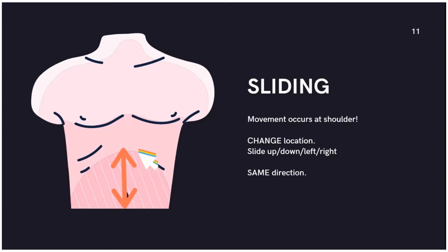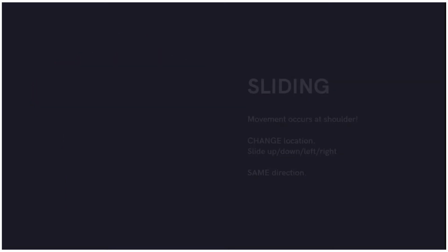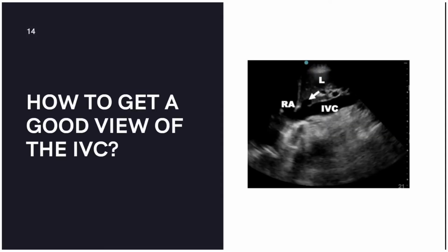All right, so now you've learned some of the basic movements. How to get a good view of the IVC depends on using all of these movements.